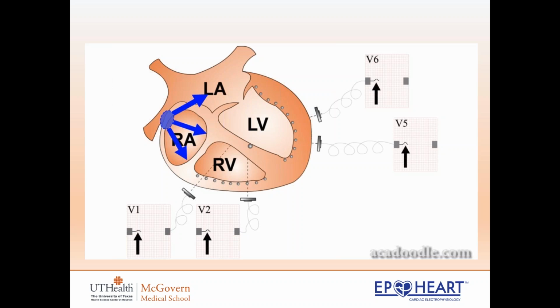Following atrial depolarization, and after the usual physiological delay in the AV node, depolarization enters the intraventricular conducting system. Depolarization traveling through the conducting system produces no deflection on the ECG, and the tracing remains on the isoelectric line. Within the ventricles, depolarization is initially released from the conducting system into the myocardium of the left side of the mid-zone of the interventricular septum.